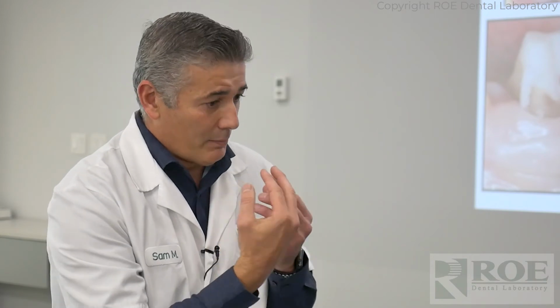And one thing we hit home today was that buccal furcation, that facial furcation, that deep one on an upper molar. Sometimes that deep furcation is not prepped back enough. They don't give us enough room to create the proper thickness of a crown and keep the margin intact. So sometimes it's not the technician's fault on how much they can contour correctly. Sometimes they have a tendency to over-contour. Talk about that buccal furcation and why.